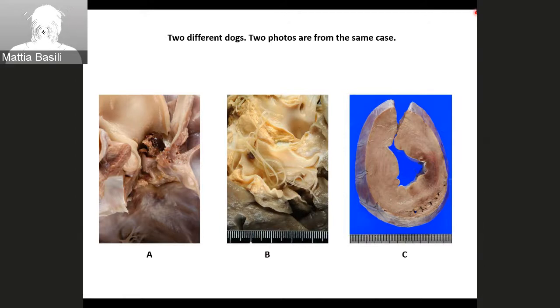So to me, that could be compatible with an infectious disease. So it could be an infectious process starting from the endocardial surface, compatible with, let's say, a myocarditis. It could be an infiltrative disease, let's say neoplastic, a bit less likely, I think. And it's less likely to be a vascular event such as an infarct, because it doesn't have a conical shape.